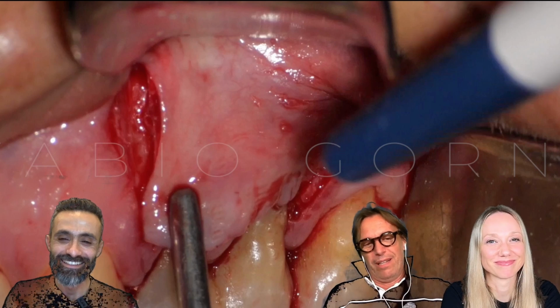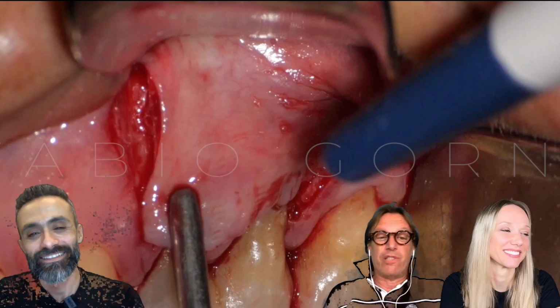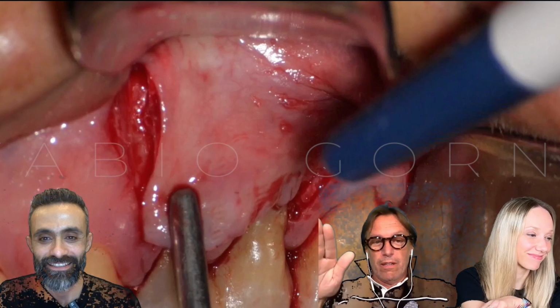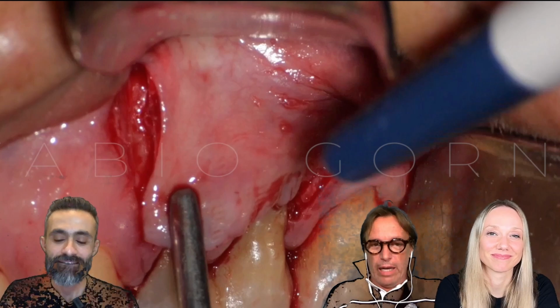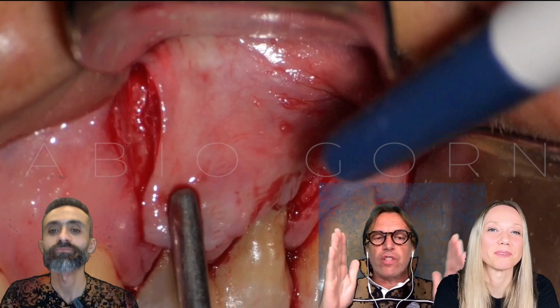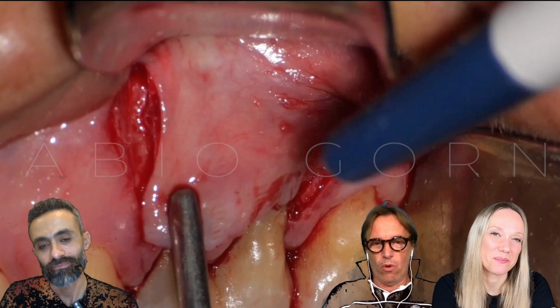No, trust me. Of course, if I use bioceramic putty, I take a little piece of bioceramic putty and I put it exactly on the top of the root. But try to condense the bioceramic putty. It will flow. The three-dimensional obturation is a must in endo in general.